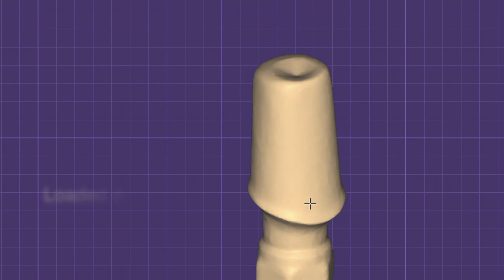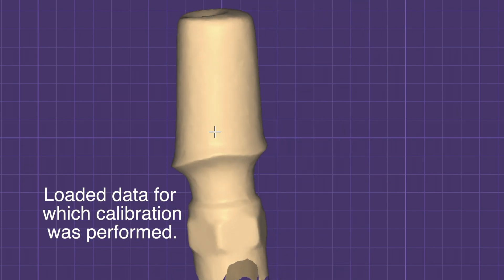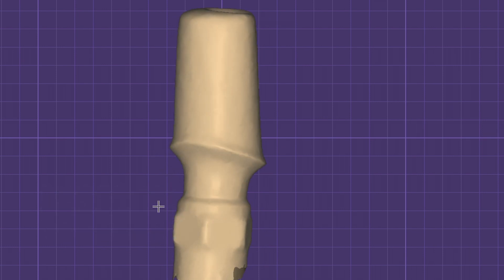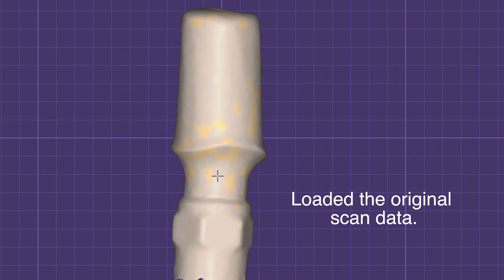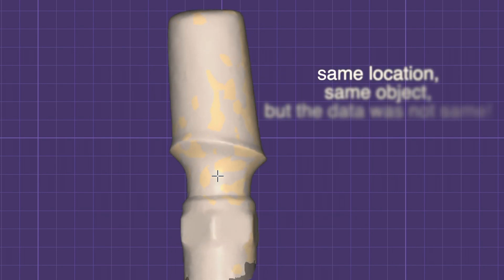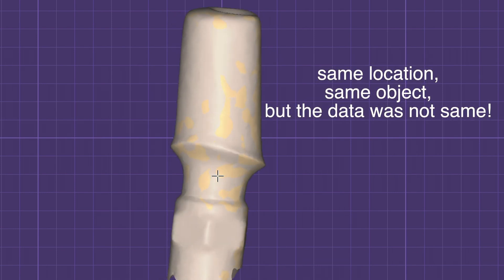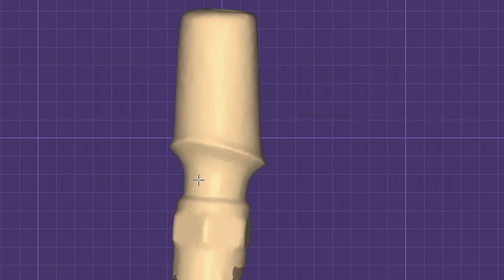And I load this scan data. And I also load the original scan data. Did you find some gap between them? As you know, this has the same location and was the same object, but the scan data was not the same, right?